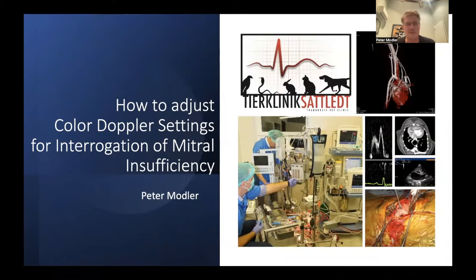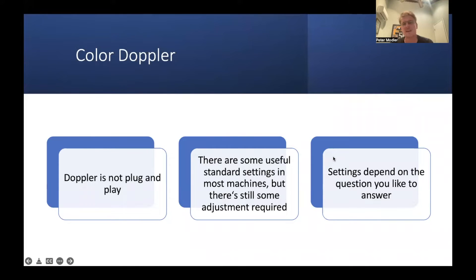Hello everybody and welcome back to five minutes of cardio time. Today I want to address a problem I frequently see when somebody starts with echocardiography: they sometimes turn on the color Doppler to interrogate the mitral valve, see a huge jet or an odd jet, and are not really able to interpret what they are seeing — just because of wrong settings. It's important to understand that Doppler, especially color Doppler, is not plug-and-play. Your Doppler settings basically depend on the question you have and what you want to interrogate.